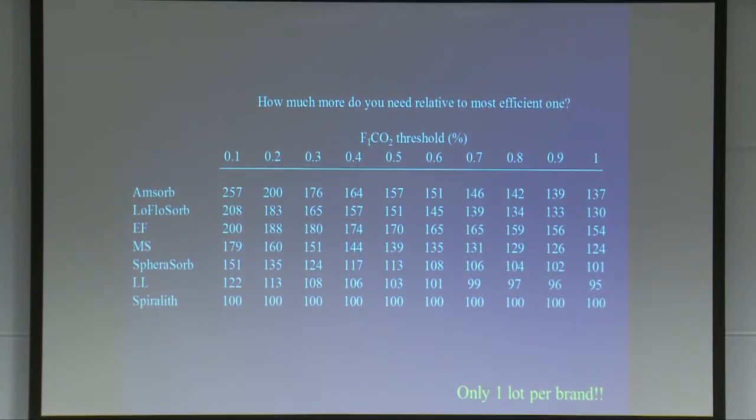It doesn't really matter. Because it's a straight line that goes to 5 liters per minute, it doesn't really matter which of the two parameters you use. And I think these graphs kind of speak for themselves. I'm not going to do any interpretation about this.